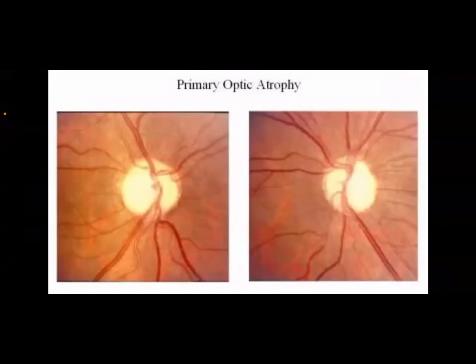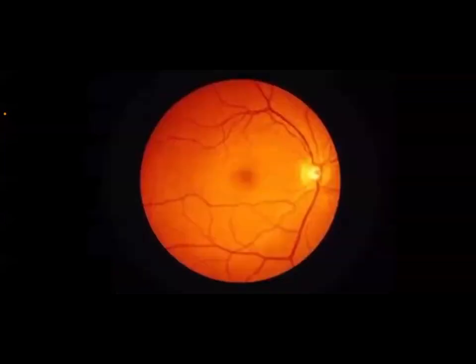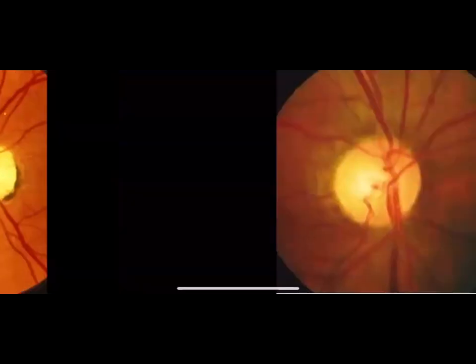What else would we want to look for? Imagine that the patient has, for instance, hypertension or idiopathic pseudotumor cerebri. Then you are able to see the blood vessels gathering toward the center of the optic disc, but you are not able to see the optic disc itself. The margins are not there. It is not that shiny moonlight-like color, and there is some swelling. What is your diagnosis? This is papilledema. I will show you a picture of papilledema.